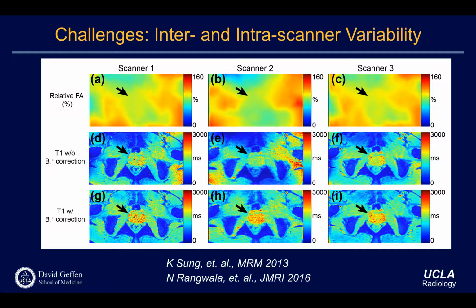Yeah, there are 2 different ways to overcome it. One is to measure and compensate. Another is to develop a technique that's insensitive to the B1 variation. So I think we're going to cover advanced topics in 229 about adiabatic RF pulse design. Those are RF pulses that are immune to B1 variation. So there's a technique that's immune, but it has limited application. You cannot use it for all different sequences. So in regular cases, I think this is the best way: you measure it and then compensate later. Okay. Any questions?